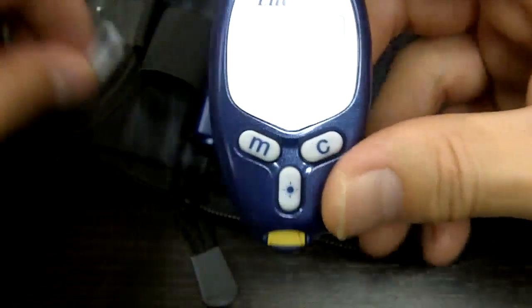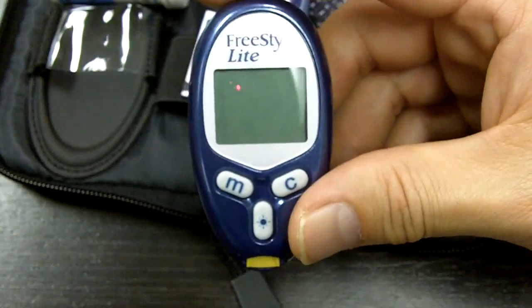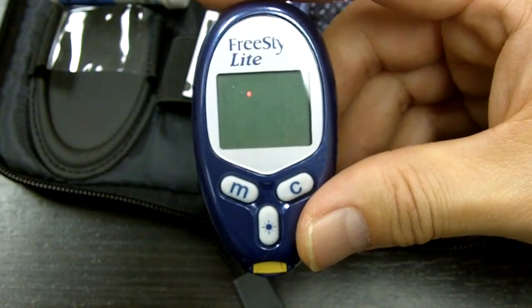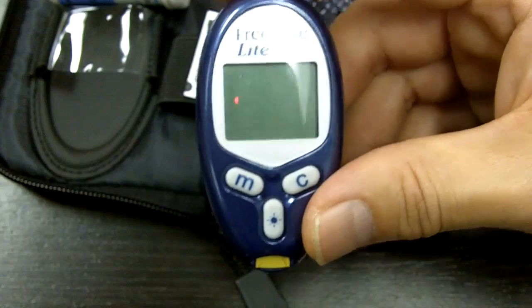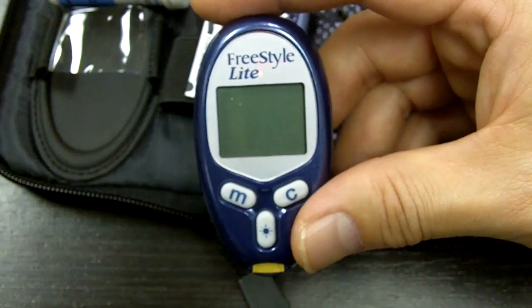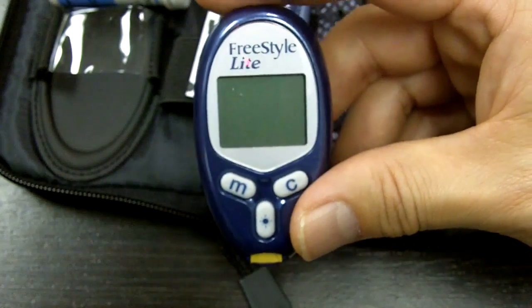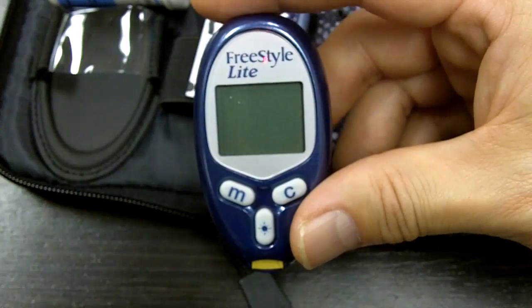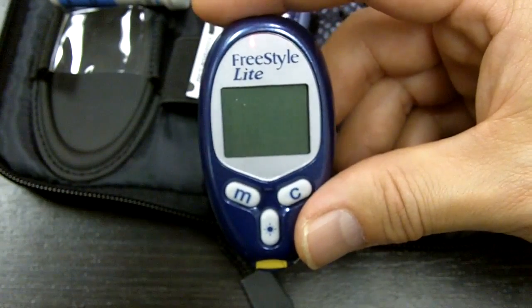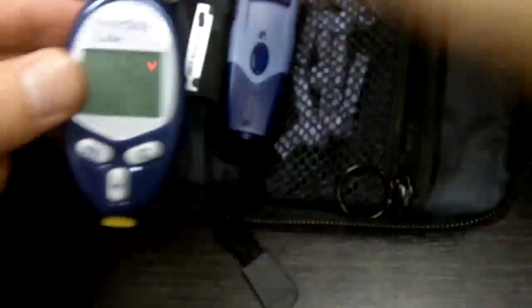That's a cool feature. But I think the biggest advantage for this meter is really the size and the sample size — I think that's the key with this meter, at least in my opinion. I'm sometimes just amazed about how little blood this thing needs, and it gives me a pretty good reading too. So that's the Freestyle Lite Meter. The other meter that goes along with this is the Freestyle Freedom, and I'm going to show you that now.